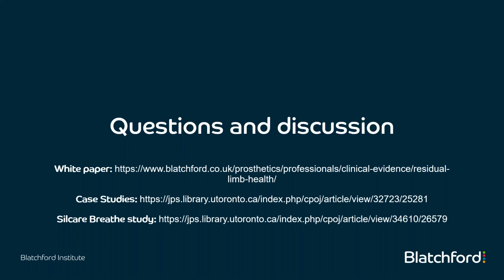Beyond that, some people can find it uncomfortable, but certainly it'll vary according to the person. Generally, if somebody's more active, like a younger, more active person, they'll want more vacuum. Older, more sedentary people, perhaps with more sensitive residual limbs, might want a bit lower pressure. Generally speaking, that's what I would have answered that with, Laura.